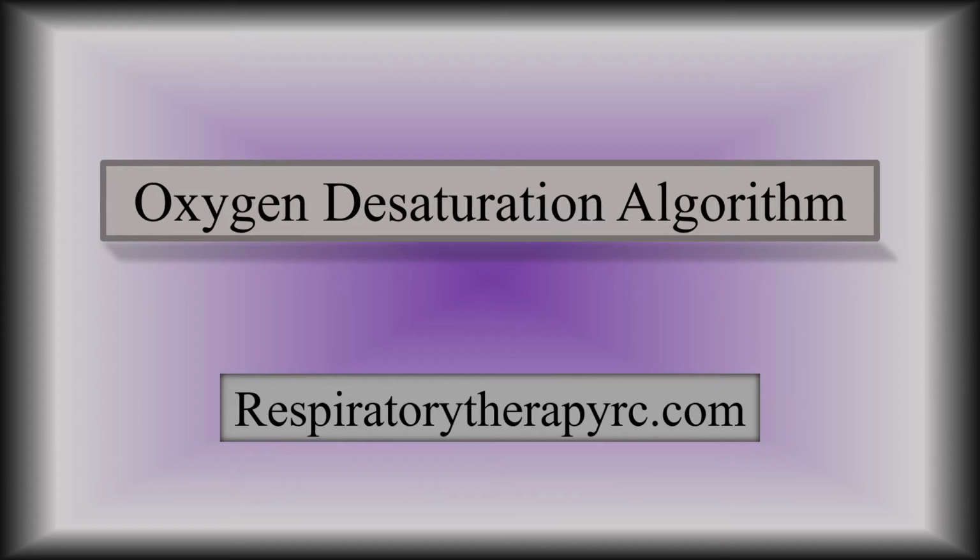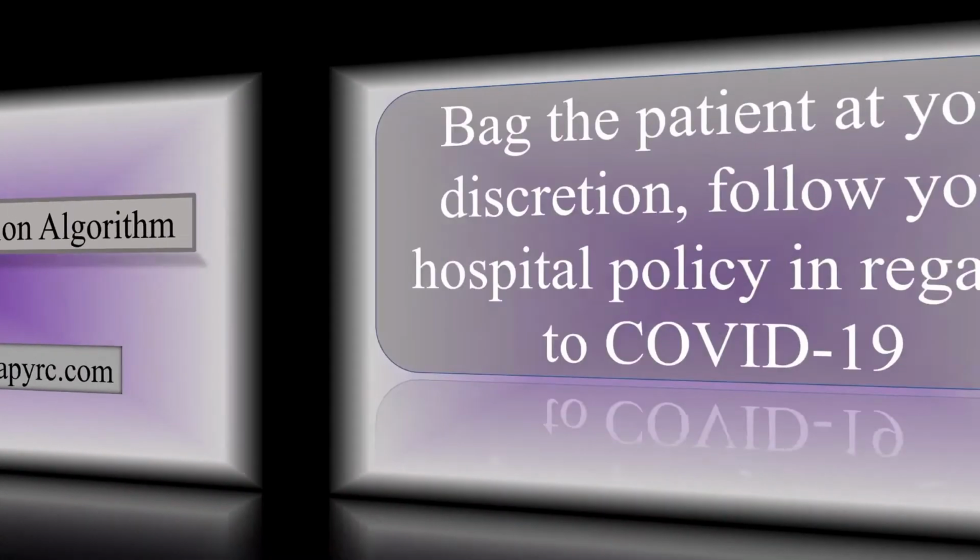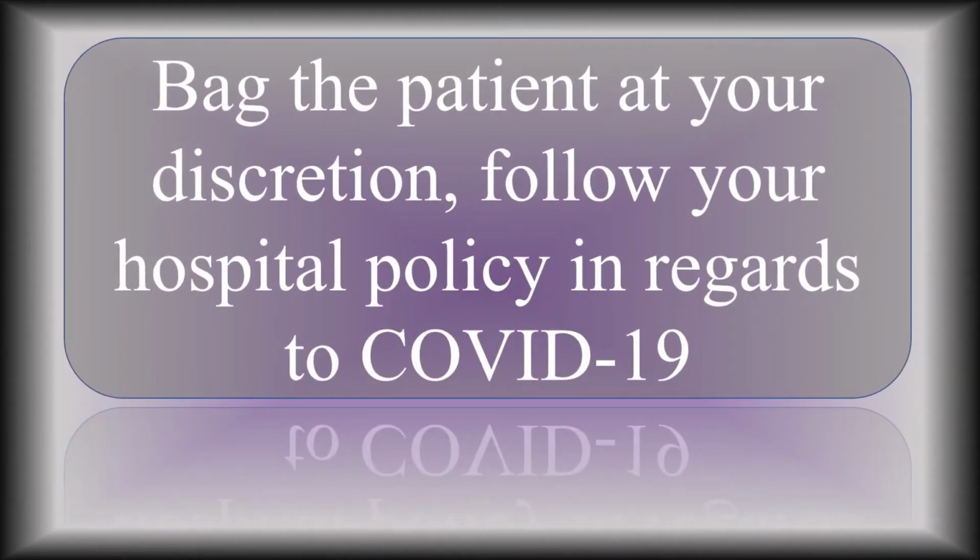So let's move on with the oxygen desaturation algorithm. This algorithm is based on patients who are intubated on the mechanical ventilator, and it's also going to start out assuming that the nurse is the first responder, because usually the nurse is the first responder, and then we'll go through as RT arrives and helps in the assessment of the patient. Bagging is always an option for patients, always bag at your discretion. However, in the time of COVID-19, remember to follow your hospital policies and guidelines.